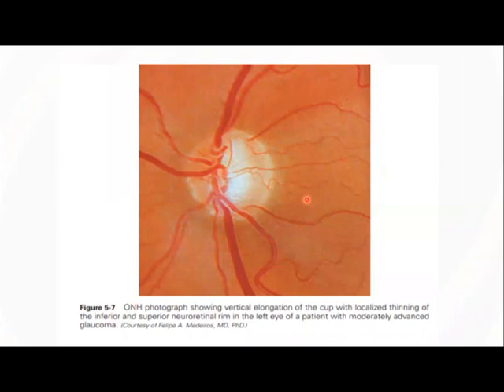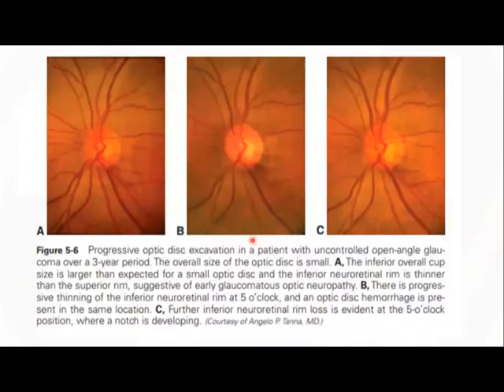In the last C image, you can see the corresponding RNFL defect also. Whatever you have mentioned regarding the disc hemorrhage in the B photograph, there is a continuation of that retinal nerve fiber layer defect. There is a dark gray band along the disc margin. In picture C, it is very much evident that there is a wedge-shaped RNFL defect along the disc margin.